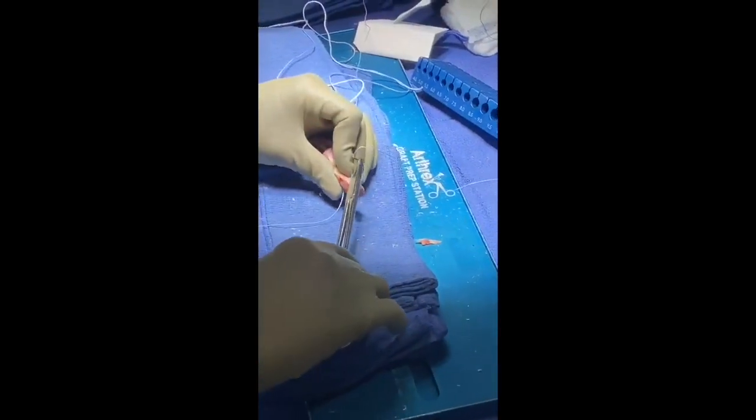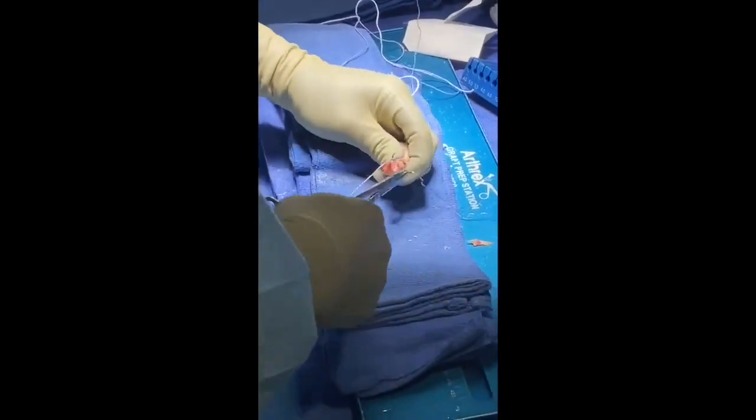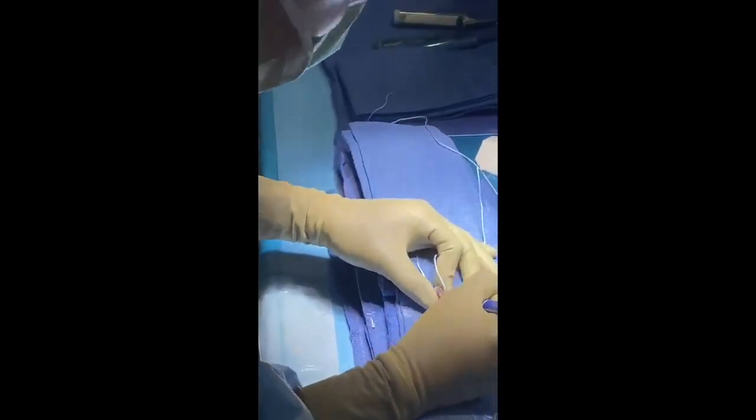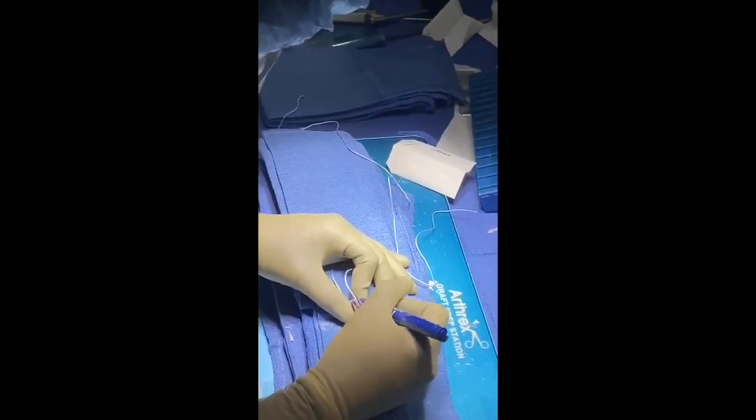For grafts involving a bone block, the passing suture should be placed more proximally along the bone to guide the tip of the bone block during passage, as opposed to more centrally placed sutures. Additionally, the bone-tendon junction should be clearly marked for both the femoral and tibial bone blocks.